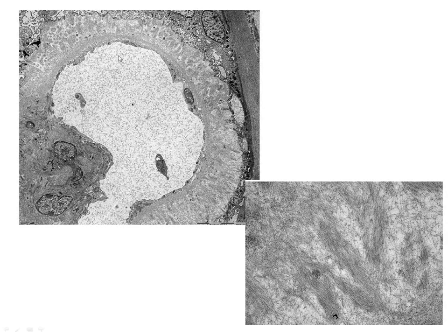So this is what happens sometimes. Here you have your capillary lumen. This is your GBM, or what used to be your GBM, and you have all these spikes of amyloid material going radially out from the glomerular basement membrane. I don't know why some of them have this phenotype versus the phenotype that's more typical, but we do see it. And if you looked at the silver stain, some of this would actually stain silver, and I don't know why, but it does.